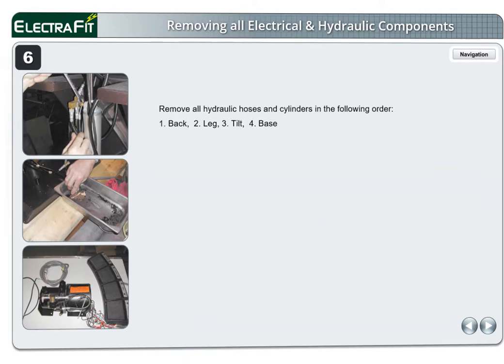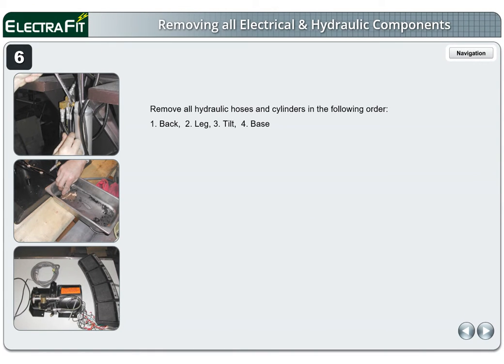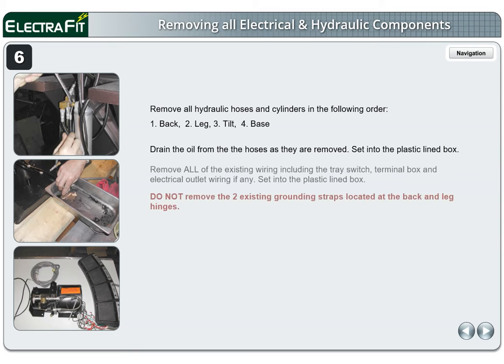Page 6. Remove all hydraulic hoses and cylinders in the following order: 1 back, 2 leg, 3 tilt, 4 base. Drain the oil from the hoses as they are removed and set into the plastic-lined box. Remove all of the existing wiring including the tray switch, terminal box, and electrical outlet wiring if any. Set into the plastic-lined box.